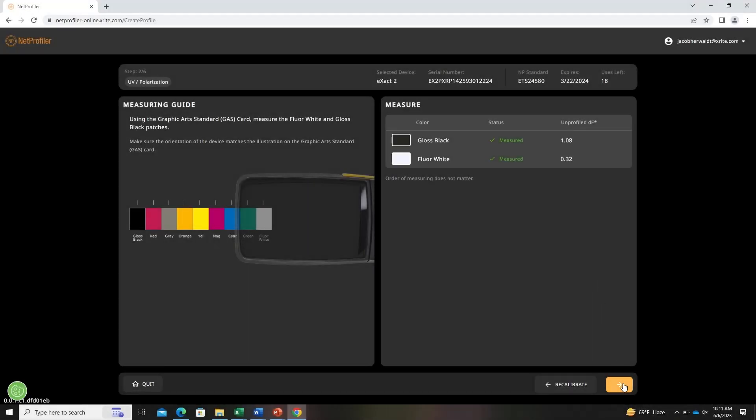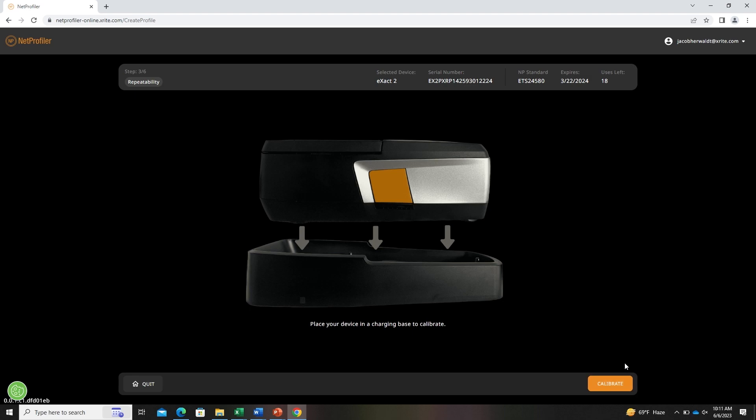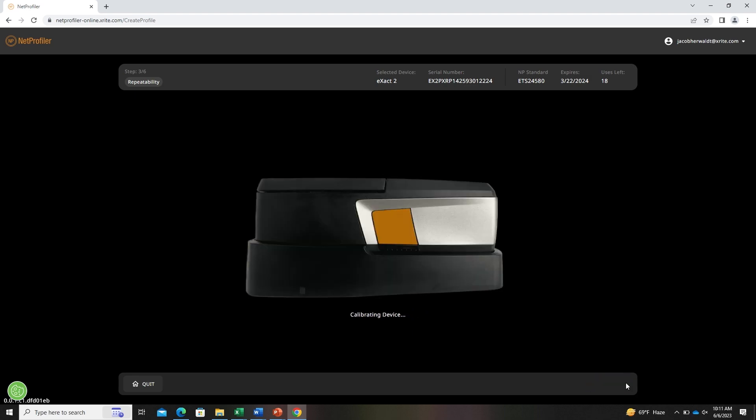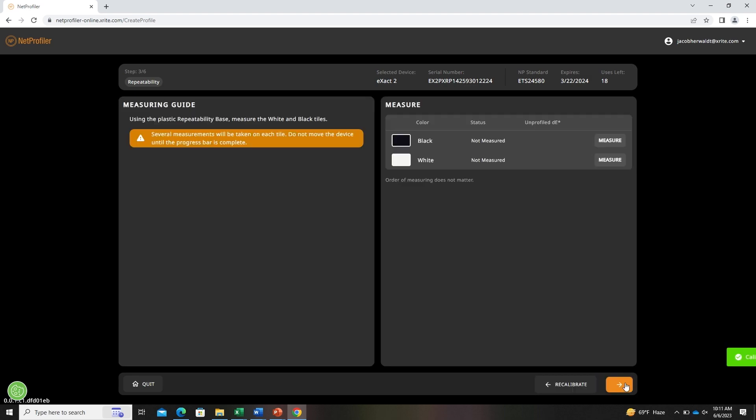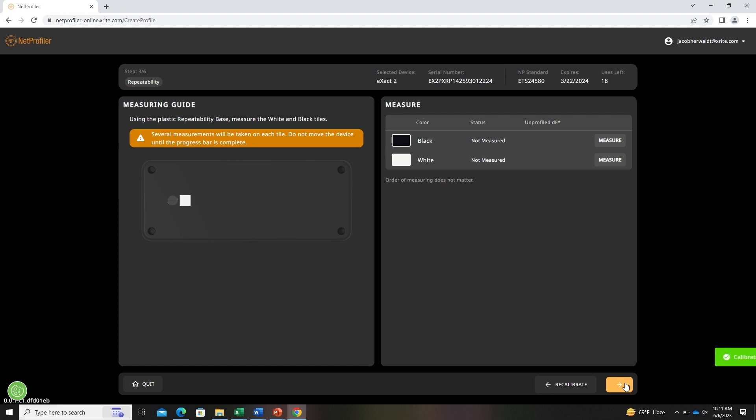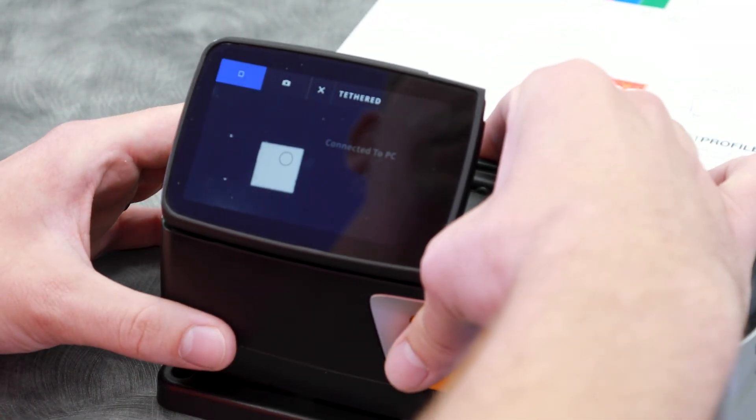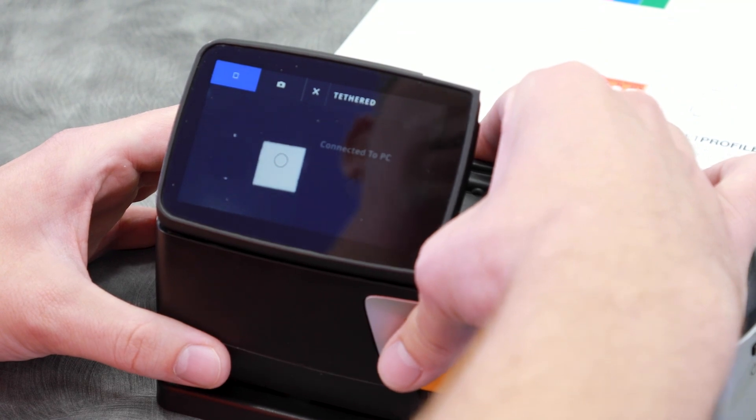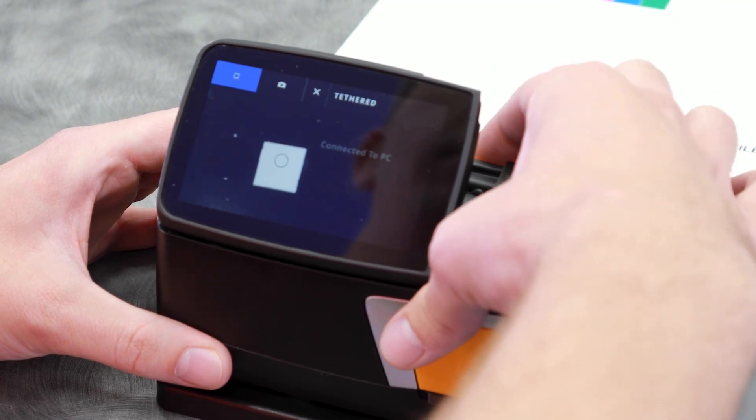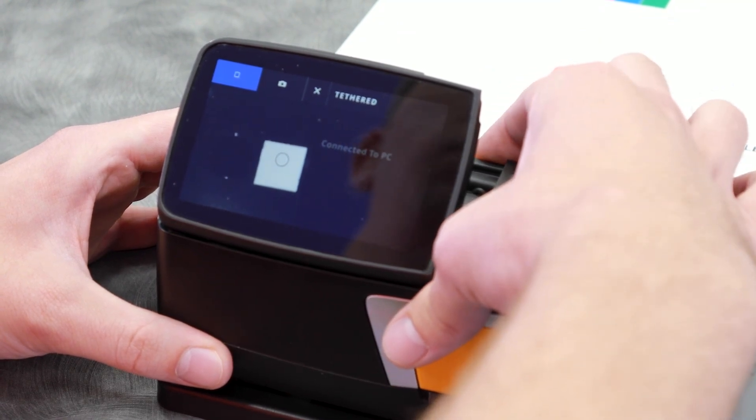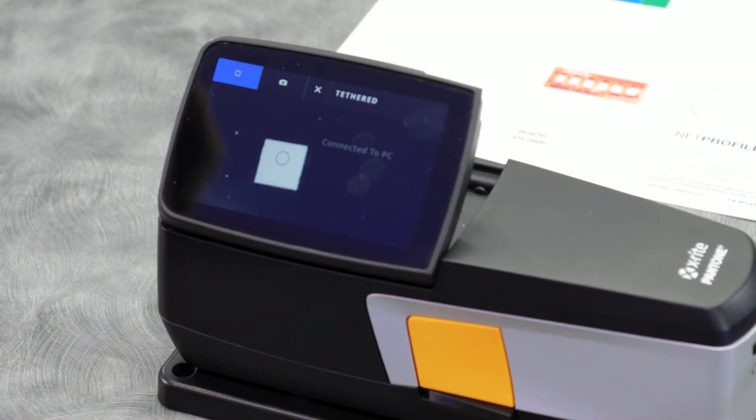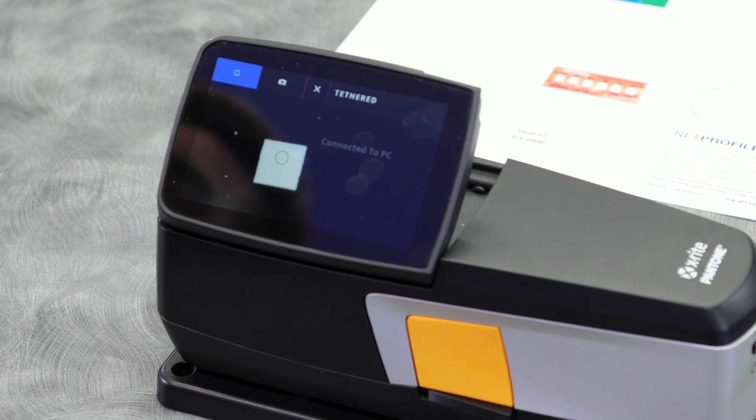From there you'll need to recalibrate the device. Next, we'll place the device on the repeatability plaque. From there you'll click the measurement button once. Do not move the device until it is done.